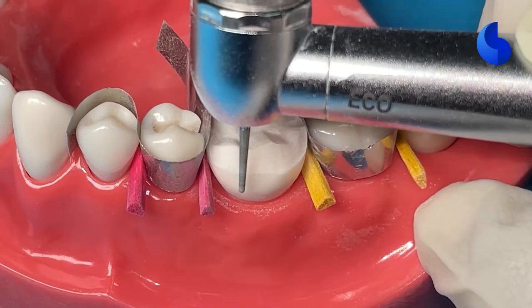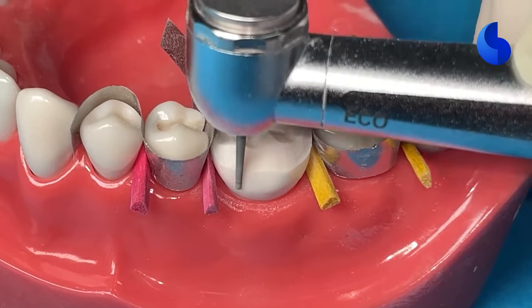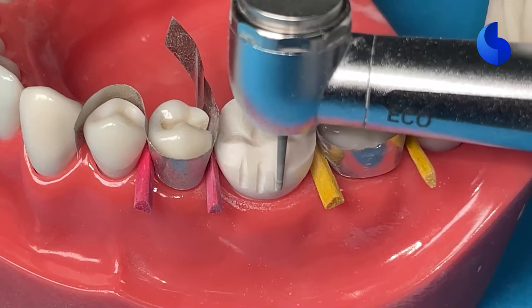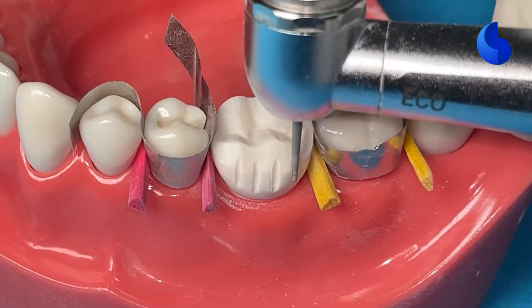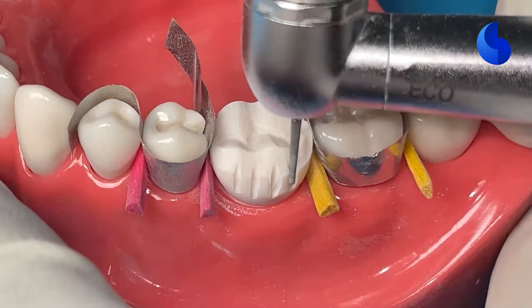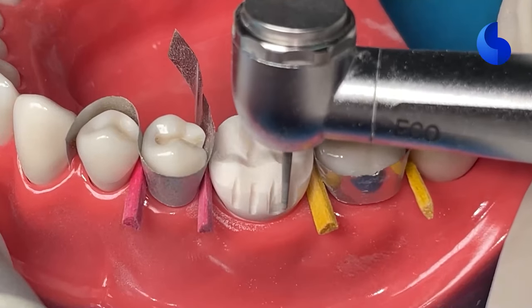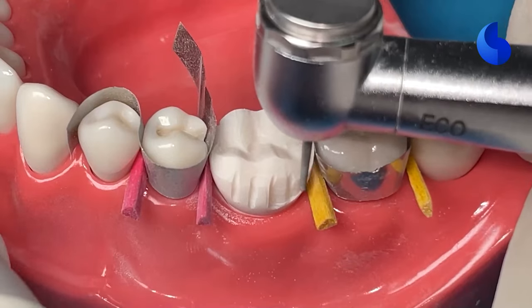Now we'll move on to the buccal axial reduction. We're continuing to use the same burr, 856-016 round-ended tapered fissure burr. So we'll start with the depth orientation grooves. As you can see, we're keeping the burr parallel to the long axis of the tooth structure. The burr itself has a taper to it, which will give you the ideal taper that's required. So don't tip the burr, and if you tip the burr, that's going to lead to over-tapering the tooth preparation, which will reduce the retention of your preparation.